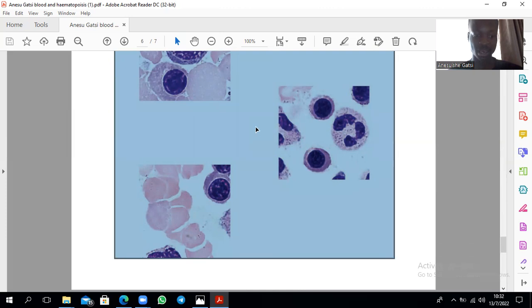Then these here are polychromatophilic. Right. The nucleus has been removed, it has been extruded. These are also known as reticulocytes. They make up 1 to 2% of the total normal circulation. Right? And they're the ones that then mature to become the red blood cells.